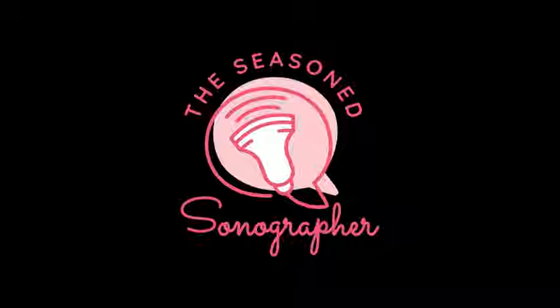You check the ventricular septum for any obvious large defects. Those small ones are hard to pick up. You'll also want to look at the right and left ventricular outflow tracts. Those should be crossing. The 3-vessel view assesses the great vessels, their size and alignment.